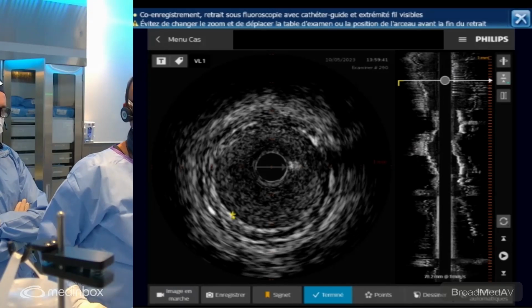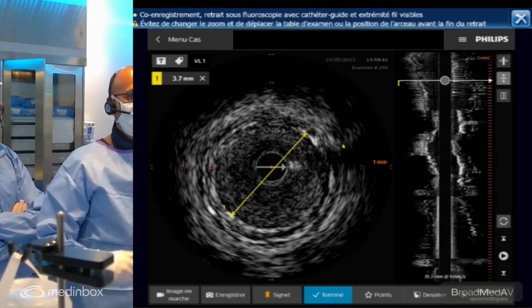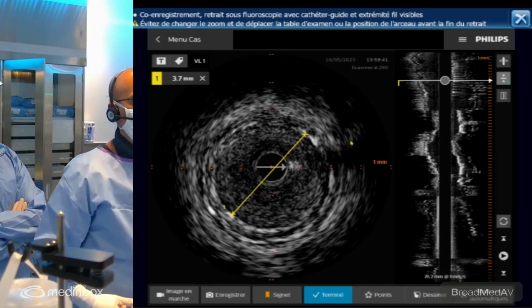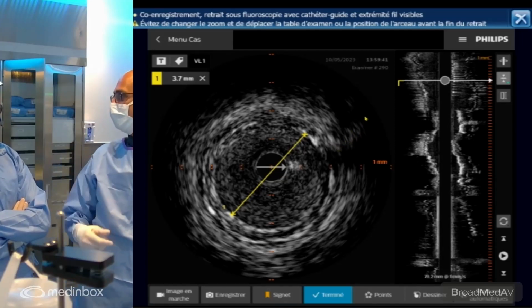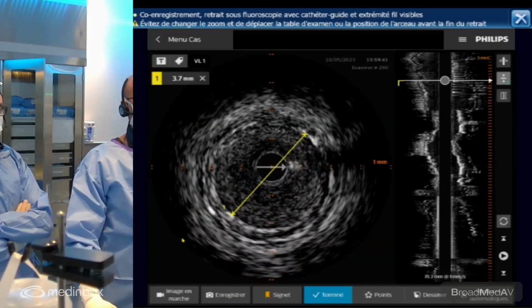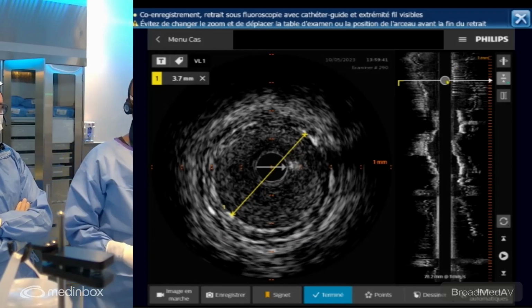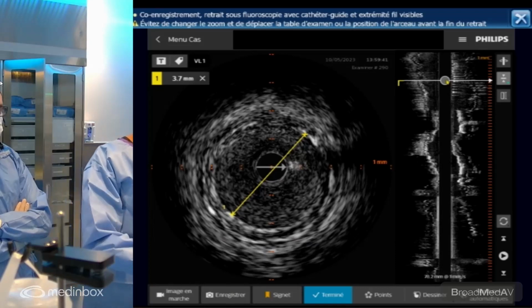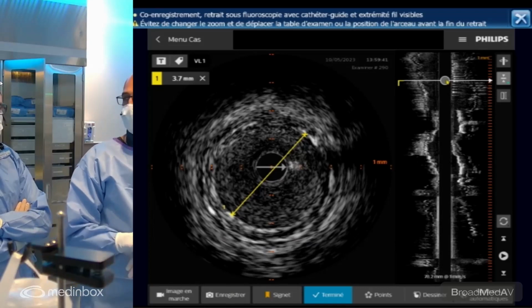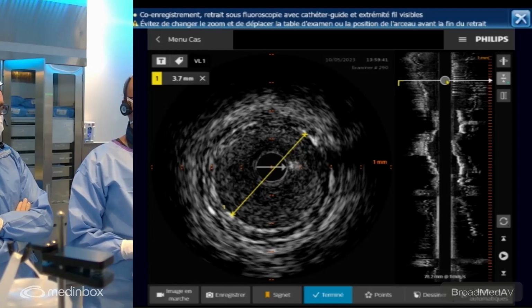It's very strange. The vessel looks pretty healthy otherwise, proximally and distally. And then you have that mid segment that's very severe. So we said 3.5. IVUS tells us 3.7. And we used a 1.75 burr, so that was a good choice. It's about half of the final diameter. Can we have the 3.0, 25 or 20 balloon non-compliant, please? So we want to make sure that we have good expansion on the balloon before putting in any stents. That way we have an optimal result.